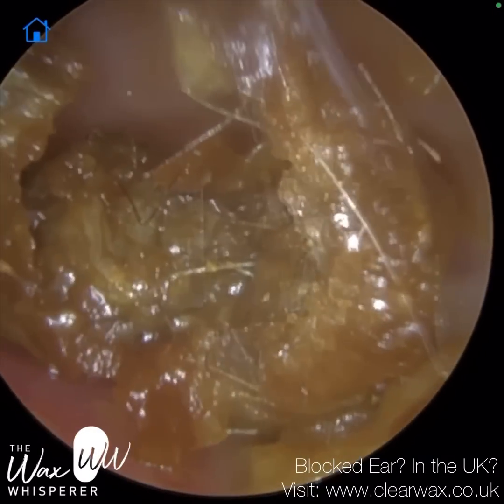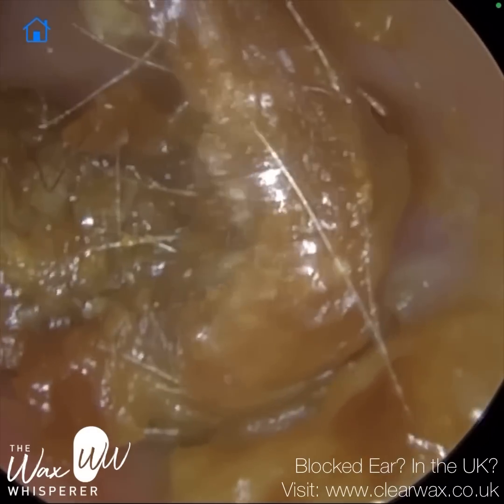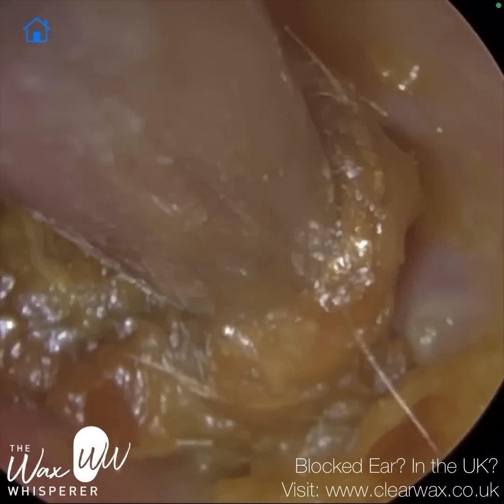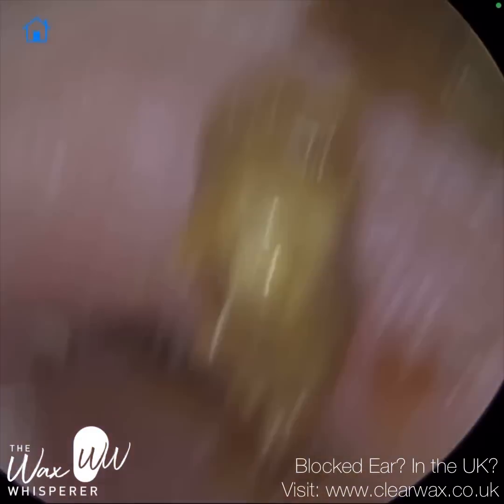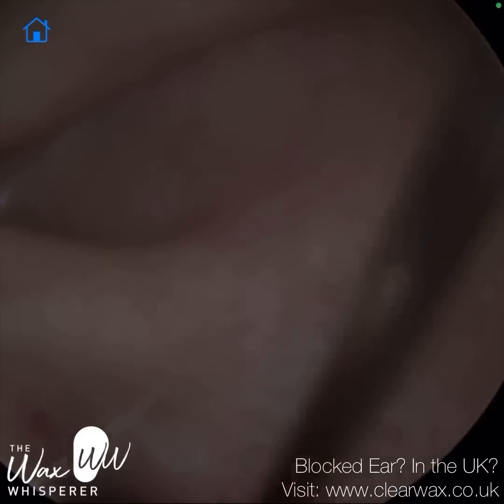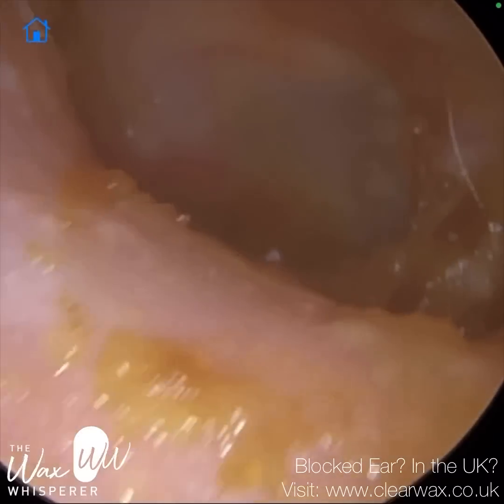We've been training people to use the endoscope since 2015, and some people find it really, really difficult to use because you're having to not only remove the wax, but also stretch and straighten the ear canal using the endoscope, so it requires a lot of what we call bilateral integration — coordination between your right and your left hand.